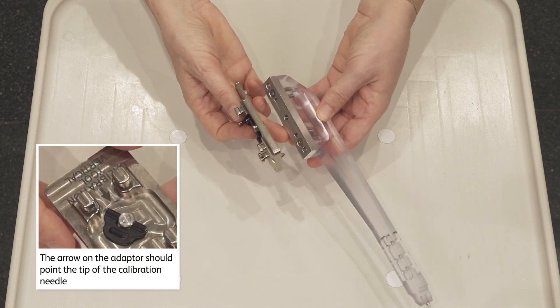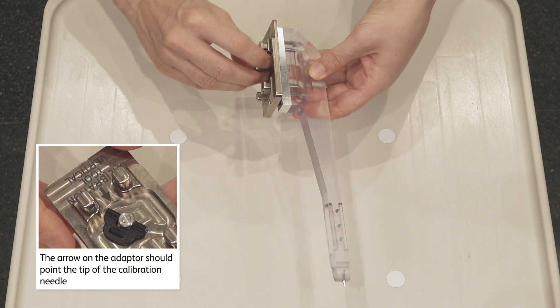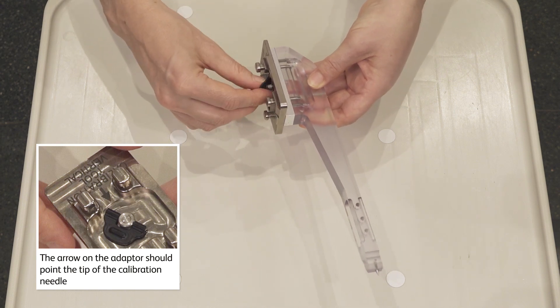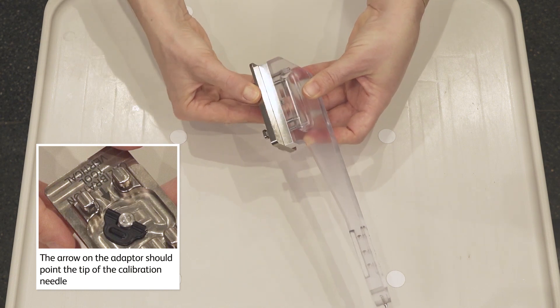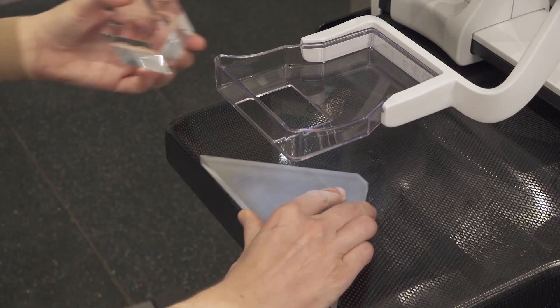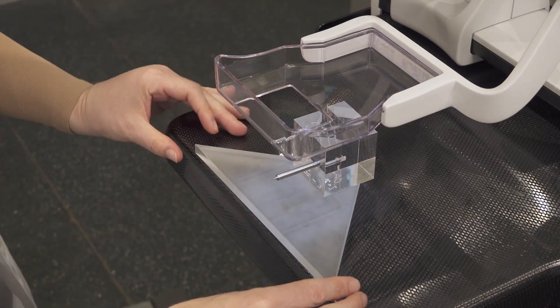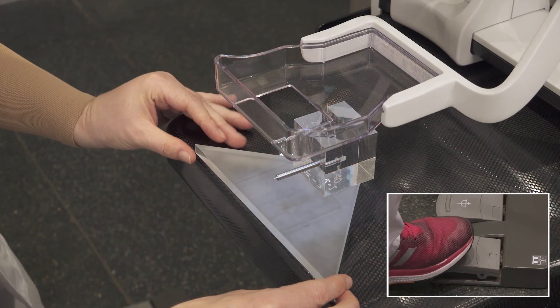For vertical approach calibration accuracy check, attach the vertical approach adapter to the calibration needle. Verify correct attachment. Place the plexi plate and the calibration phantom over the breast support as indicated.